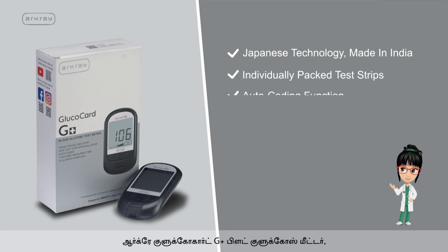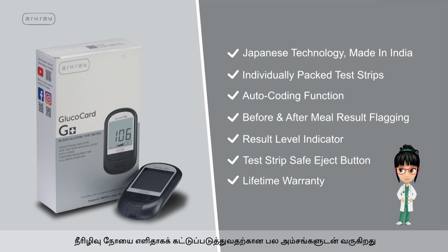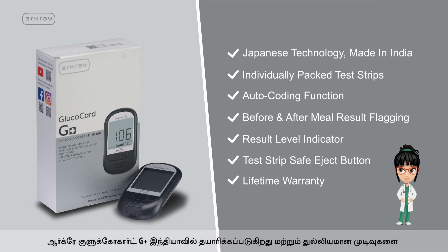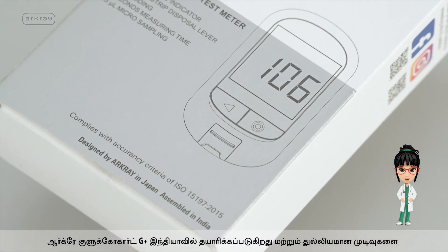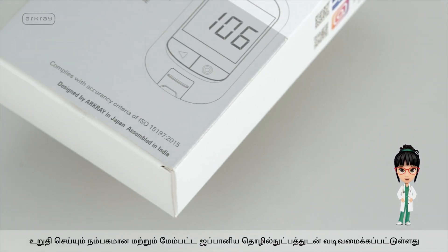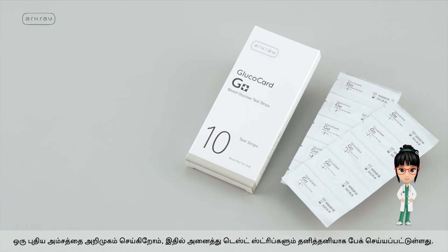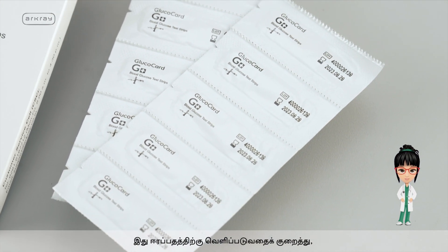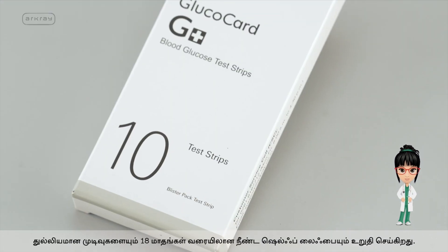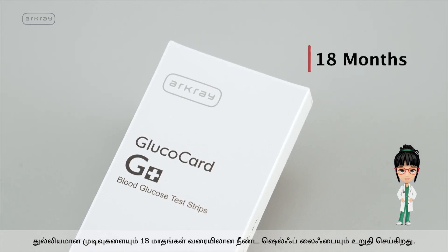R-Cray Glucocard G Plus Blood Glucose Meter comes with many features that make diabetes management easy. Made in India and designed with trusted and advanced Japanese technology, it ensures accurate results. All test strips are individually packed, minimizing exposure to humidity and ensuring accurate results with a longer shelf life of up to 18 months.